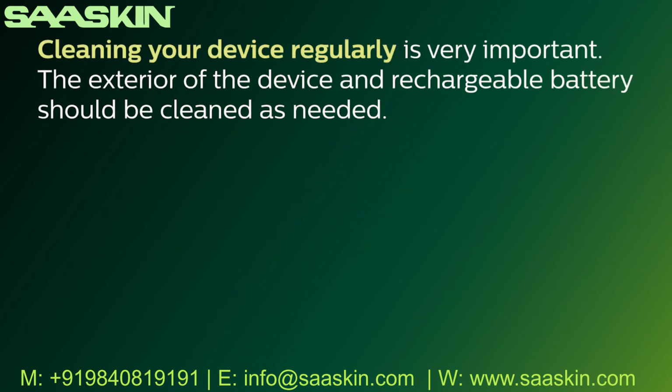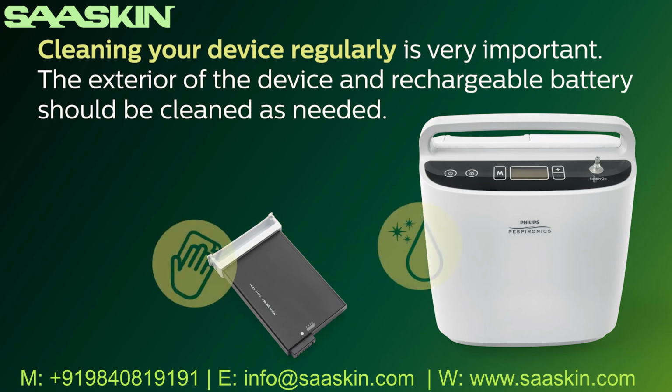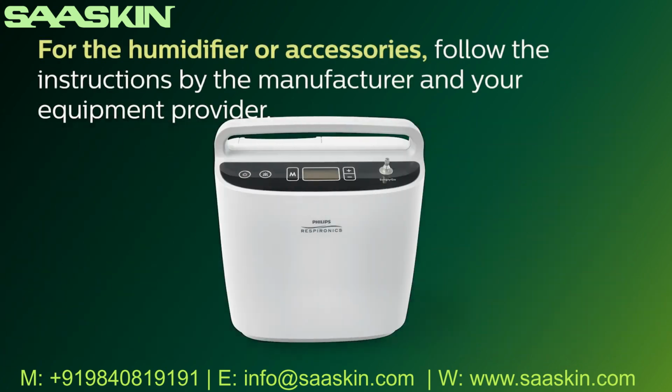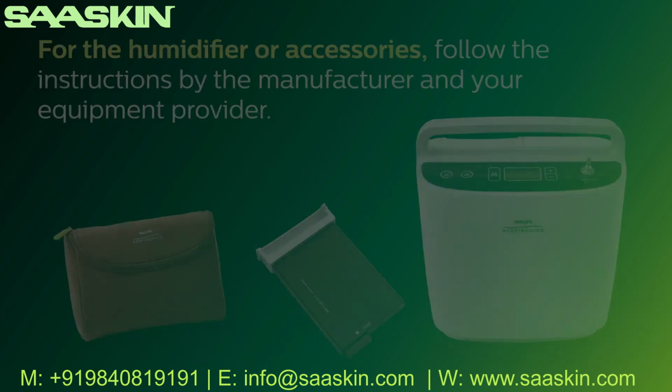Cleaning your device regularly is very important. The exterior of the device and rechargeable battery should be cleaned as needed. Clean the device exterior using a damp cloth with a mild household cleaner and wipe it dry. For the humidifier or accessories, follow the instructions by the manufacturer and your equipment provider.